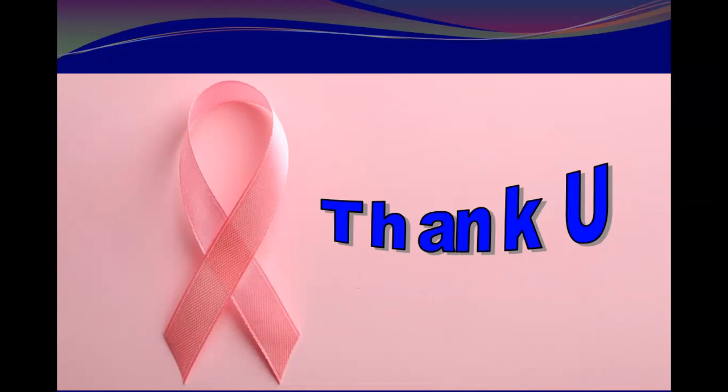Okay. And the axillary tail is not included. Just imagine and divide the breast equally into 3 parts. The first part close to the nipple area is zone 1. The second part is the part far from the nipple, at the periphery of the breast, circling throughout the breast. At the periphery of the breast is zone 3. And in between is zone 2. And it is subjective.